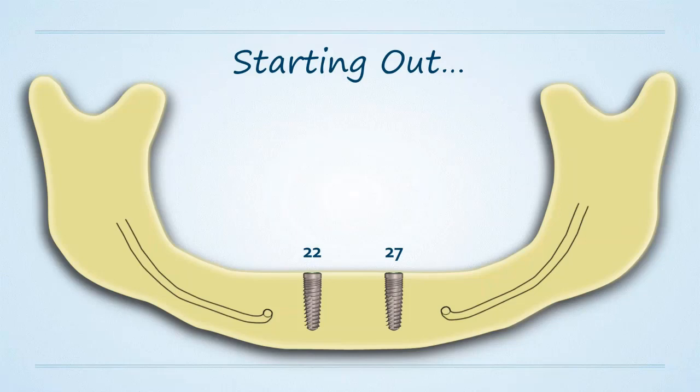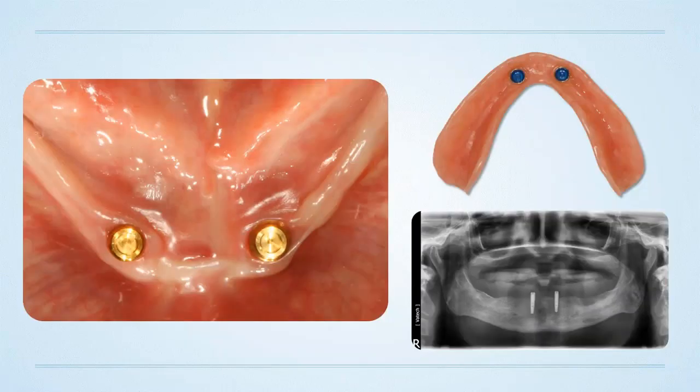And that's true. Those are pretty good go-to places for our first option for our patients. And we know that that's a pretty predictable, reliable position for our implants and for our surgical procedures.